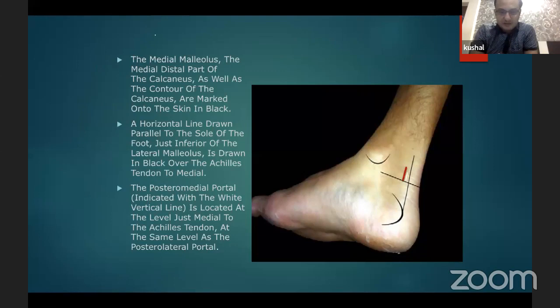So that's the medial portal I was talking about. Be very careful. Don't go too much medial, because then you will be too near the neurovascular bundle and the tibial nerve. I wouldn't want that to happen. So stay flush medial and just above the line that we have already drawn. If you look carefully, you realize that the line, which just kisses the tip of the lateral malleolus, is actually quite below the tip of the medial malleolus, right? So make sure that this line doesn't touch the medial malleolus, which would mean that your medial portal would be a bit too superior. Keep that in mind when you draw the line.